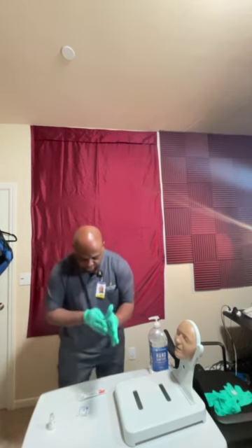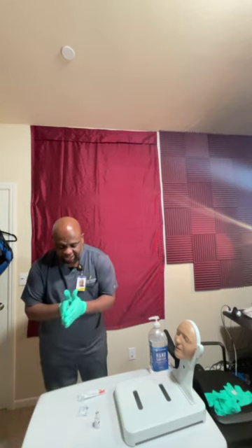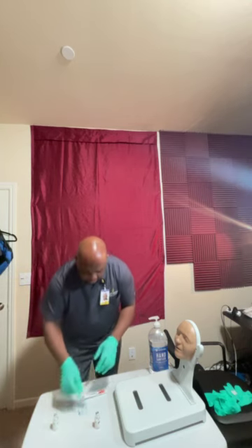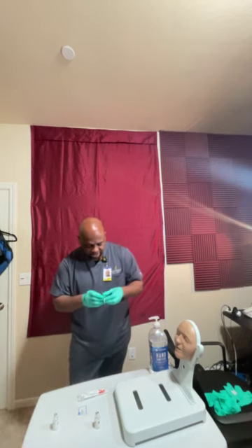That one is slightly rubbed between the hands. Same thing with the other one. I'm going to slightly roll it between my hands, right? Okay. Now from there, I'm going to use alcohol, one wipe for each bottle. I'll go ahead and wipe down the top.